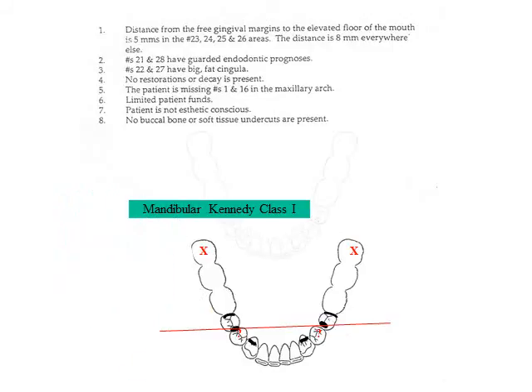The major connector is selected. However, examination of the patient's prior partial denture, if any, will be useful in selection of the major connector. In this diagram, the linguoplate major connector is shown. As in all mandibular major connectors, it should be rigid.